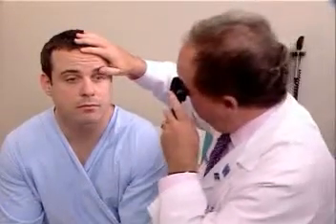We repeat the same procedure on the left eye using your left eye and holding the equipment in your left hand. And again, I'm about 15 to 20 degrees off of midline, and keep looking in the distance. And as one gets closer to the patient, the diopter wheel focuses first as we go through the cornea, the lens, the vitreous, and now the retina.